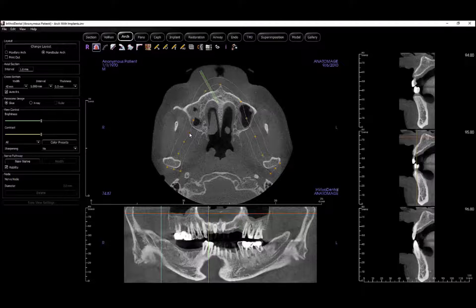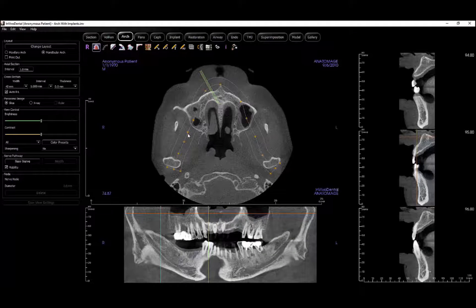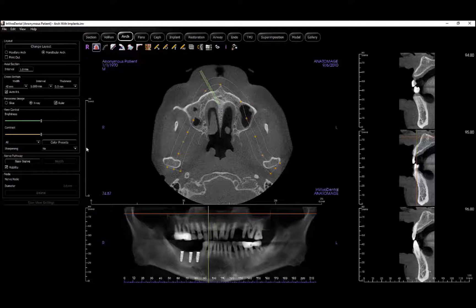After finishing the arch spline, you can make adjustments by moving the points to better display the nerve canal or by changing the width of the capture area.